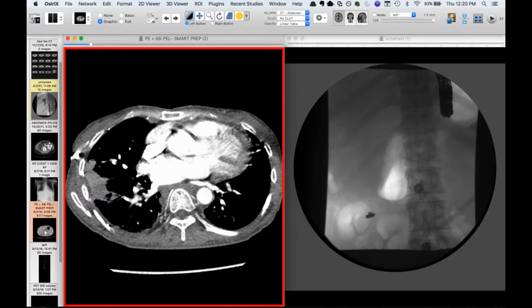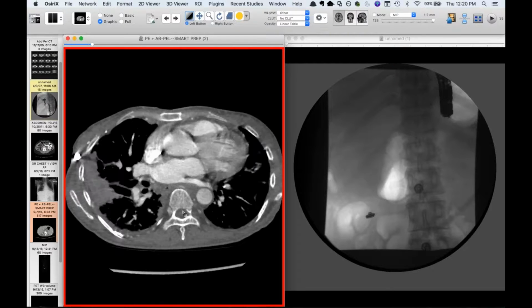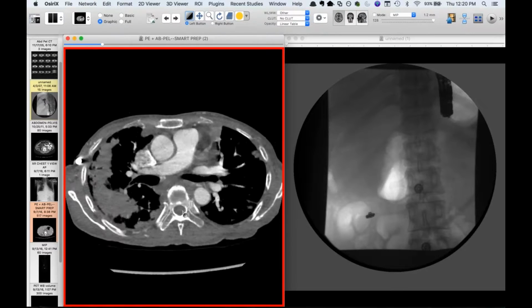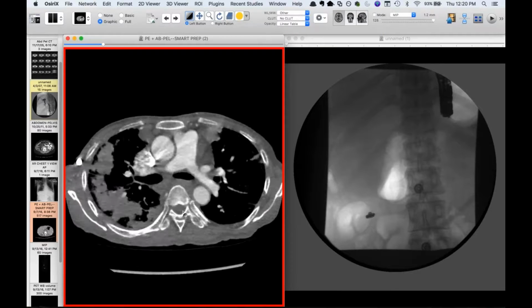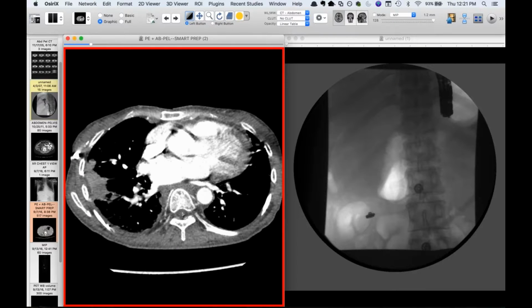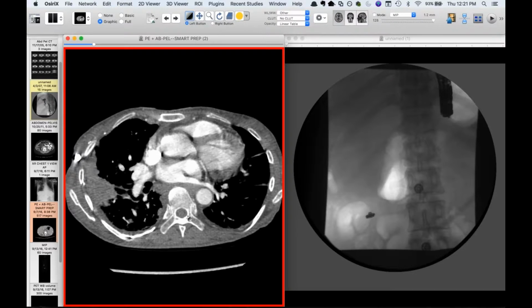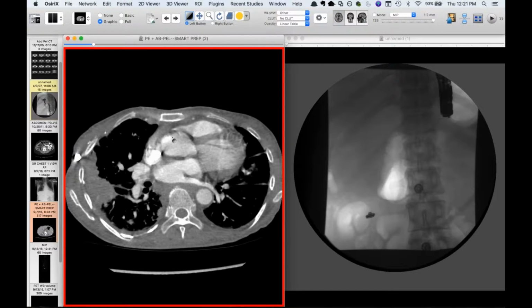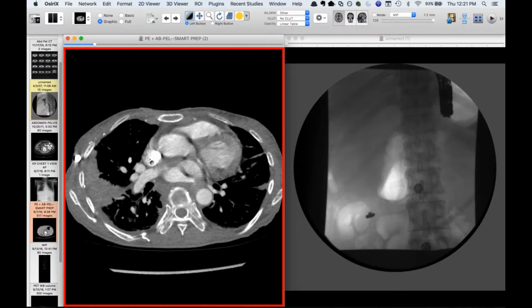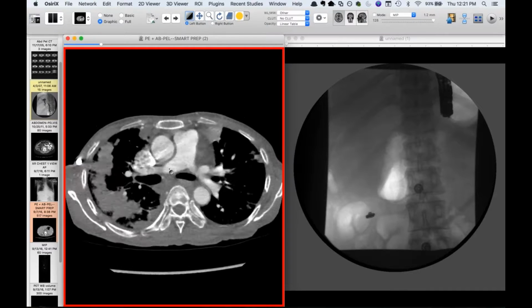Yeah, it's not pinching off the veins. You're trying to explain the septal thickening that we saw here? Yeah, and we have a recent case of a guy who has pulmonary hypertension, who's got something pinching off his pulmonary veins. He's got a lot of mediastinal soft tissue, and IgG4 disease was our consideration. So I was just curious. I think it's just lymphadenopathy involved too. There were internal mammary nodes.